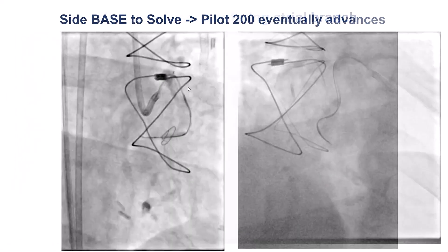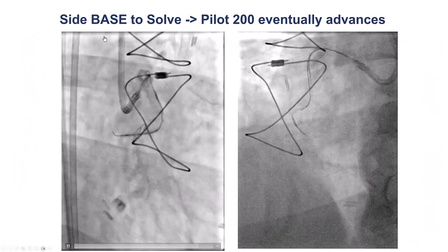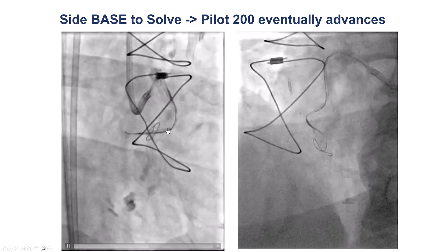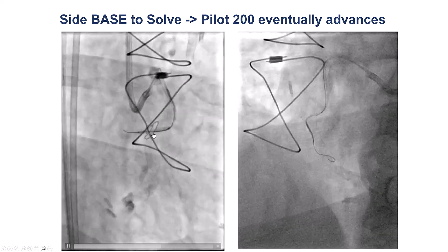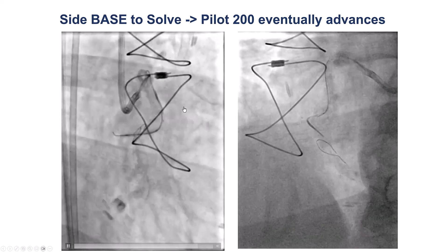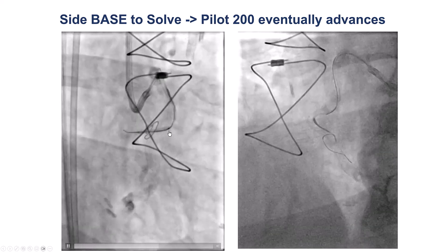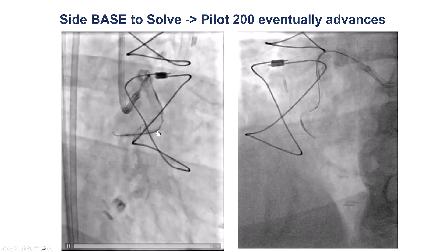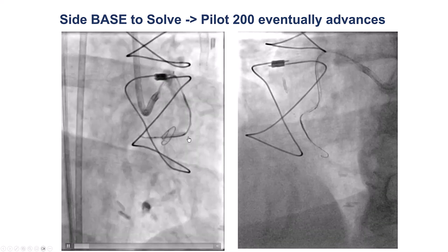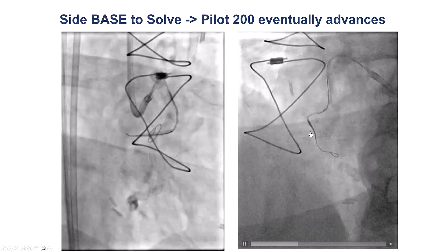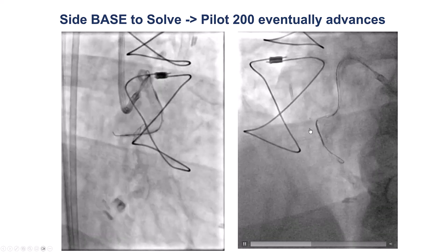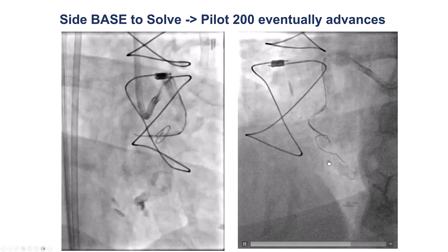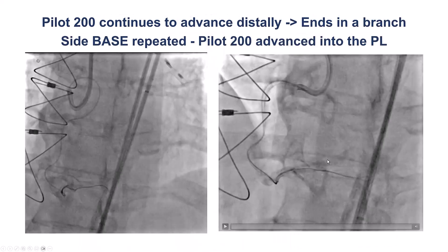So what to do next? We decided to do the side-BASE technique, which means we advanced the balloon into this atrial branch and then used another wire, a Pilot 200, that creates large knuckles. By doing that, we were able to advance the knuckle across the origin of the atrial branch, going towards the distal right coronary artery.